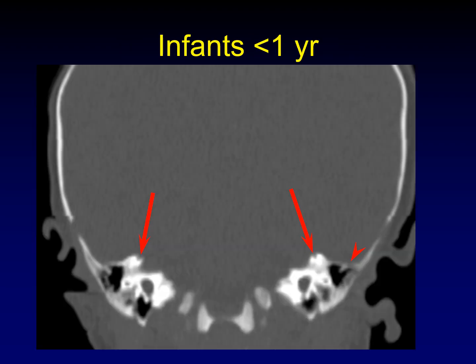Here's what I was talking about in infants less than one year old. There are apparent gaps in the tegman mastoidium, and look at the superior semicircular canals — you would call that superior semicircular canal dehiscence in an adult. But this is a child less than one year old, and we know it takes about a year for the temporal bone to fully ossify. These are all perfectly normal.